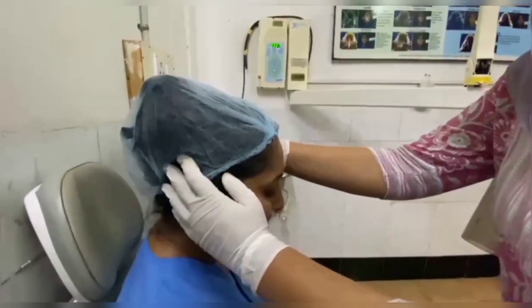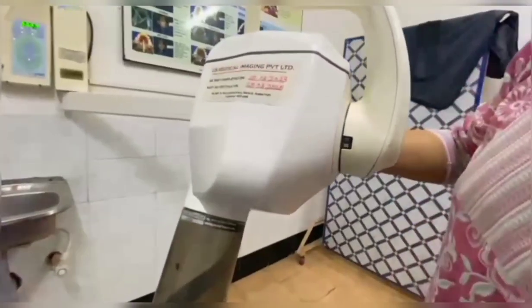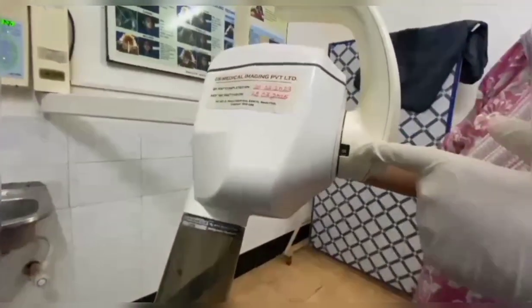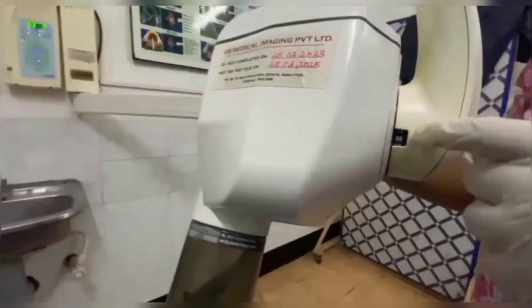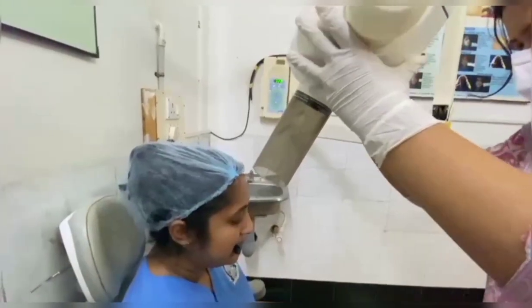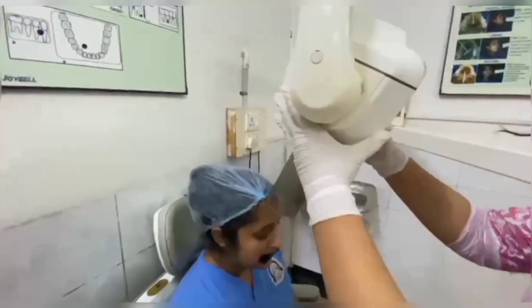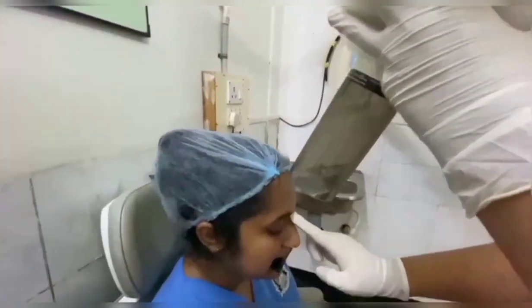The patient's head must be positioned such that the upper arch is parallel to the floor and the mid-sagittal plane is perpendicular to the floor. The central ray is directed at a horizontal angulation of 0 degrees and a vertical angulation of plus 65 degrees. The PID is positioned in such a way that the central ray enters the patient's face through the bridge of the nose.